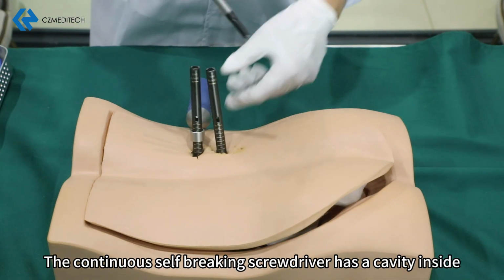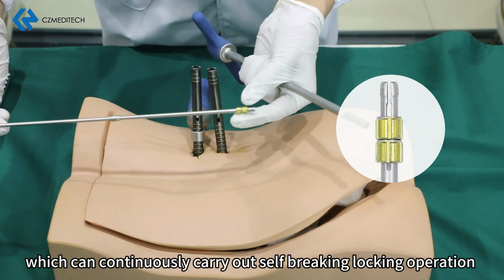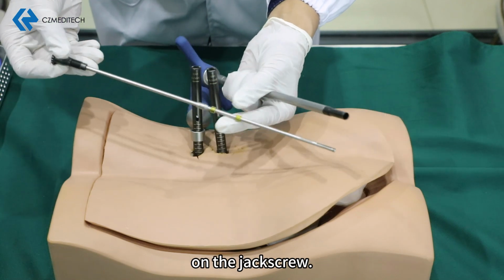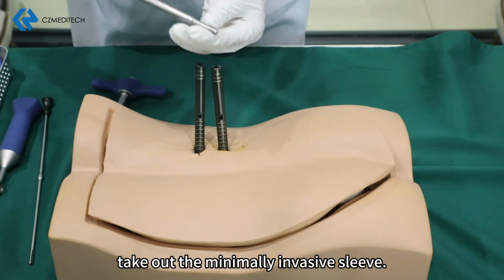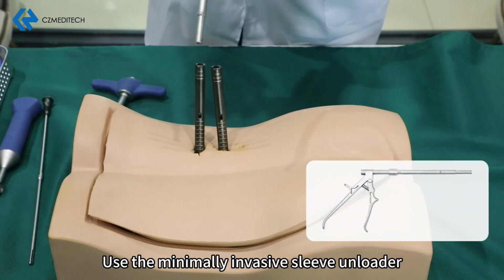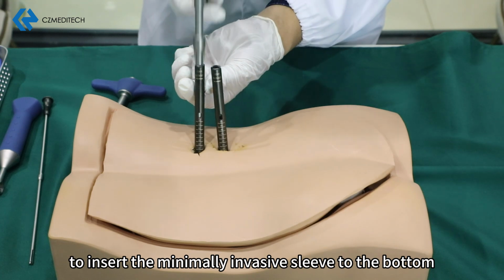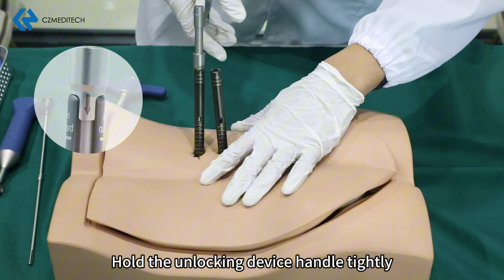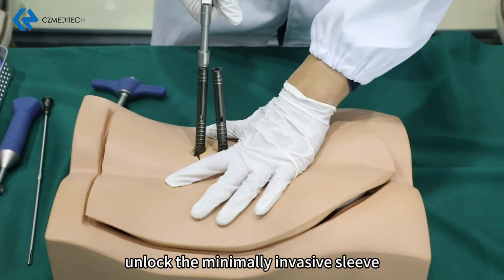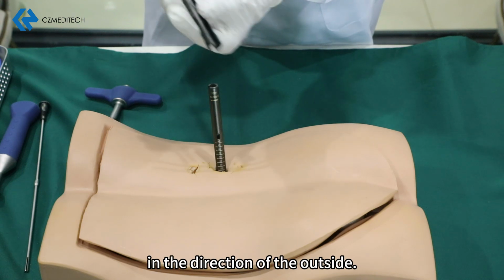The continuous self-breaking screwdriver has a cavity inside, which can continuously carry out self-breaking locking operation on the jack screw. After locking all jack screws, take out the minimally invasive sleeve. Use the minimally invasive sleeve unloader to insert to the bottom of the minimally invasive sleeve. Hold the unlocking device handle tightly. Unlock the minimally invasive sleeve and pull it out in the direction of the outside.